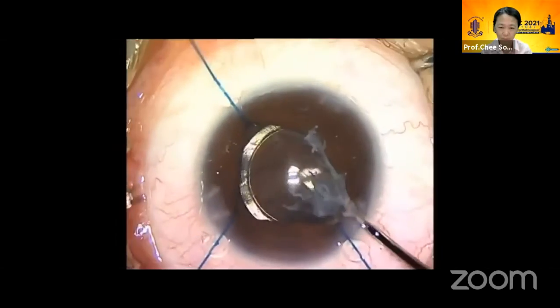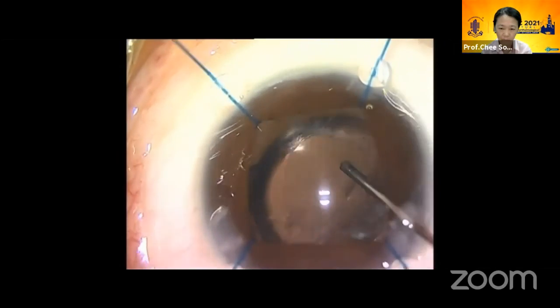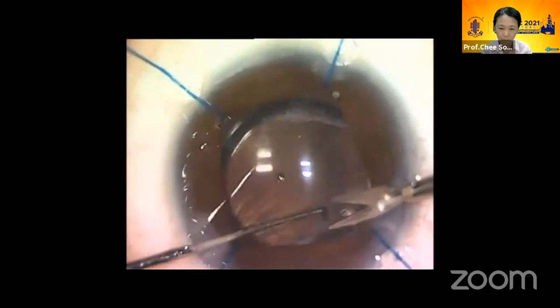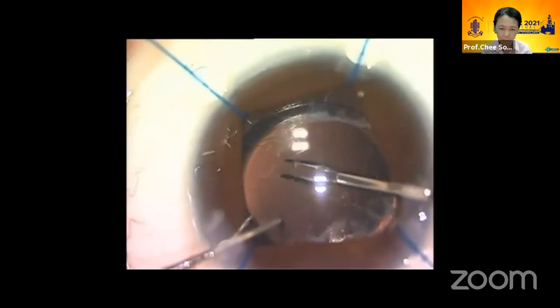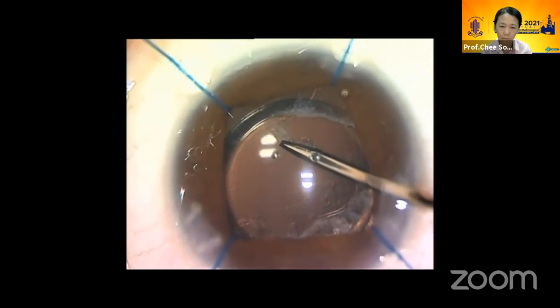And we have to switch hands as we move around, but we're able to do this relatively completely 360 degrees around. Once we've removed the fibrosis, you can see the capsule opening has enlarged now, and the folds are no longer so tense. After injecting enough dispersive viscoelastic, we inject a capsular tension ring. You need to be very careful there in case you have any resistance that you do not push, in case you rupture the bag.